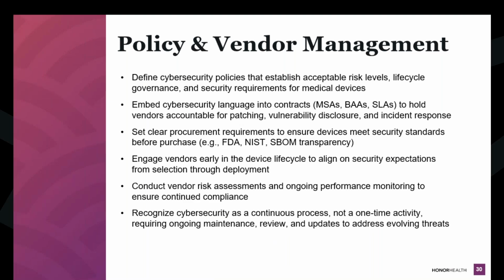So, making the vendors behave. That's a full-time job, right? So they're going to sell to the clinicians. They're going to tell you everything is safe. And so basically you have to be the voice of reason and say, that's great. It's safe. Put it in writing.